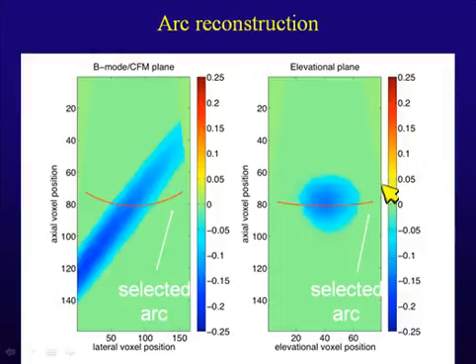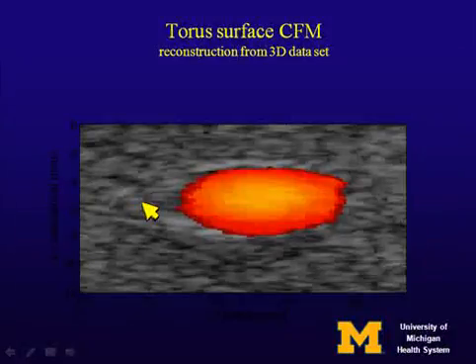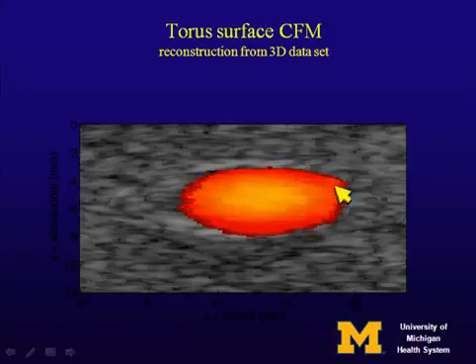This is a picture of this. This is the C-scan from a transverse image, and this would be what you would see in a longitudinal image. We want the plane that corresponds to this slice coming in and out of that section. And this is what you get. You get this sort of closed surface that's actually a torus, but it doesn't matter if you want to consider it a plane, where you just add up all of these velocity elements, and that's volume flow.